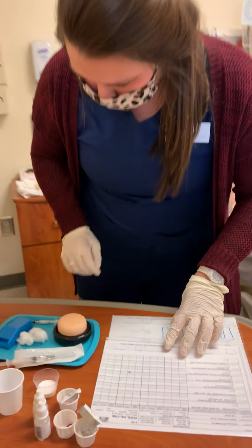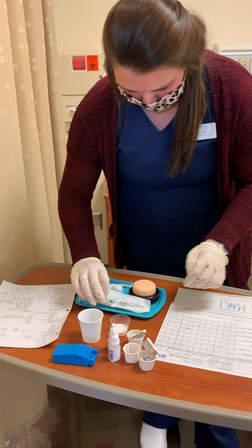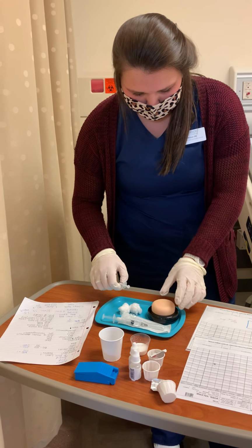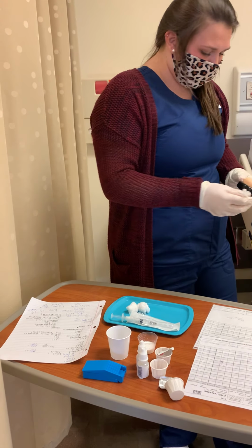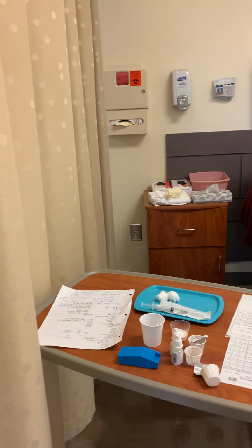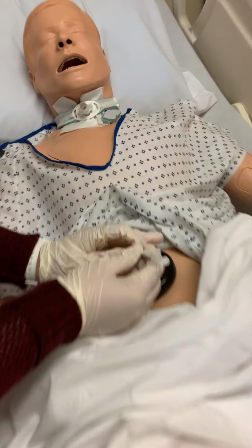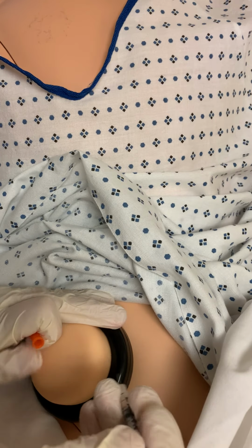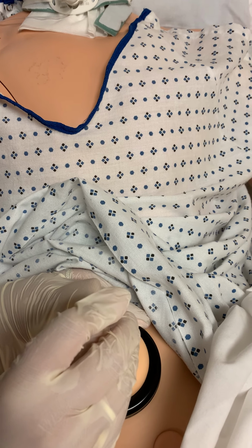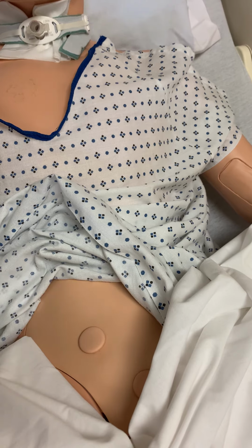All right, now we're gonna administer your insulin. Are you feeling any soreness in your abdomen? All right, this is just your insulin. 1, 2, 3. All right, good job, Miss Valerie, excuse me.